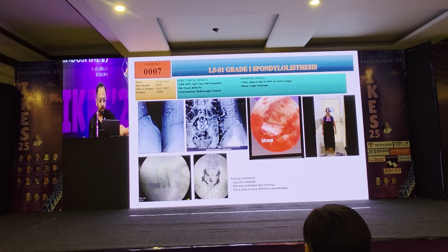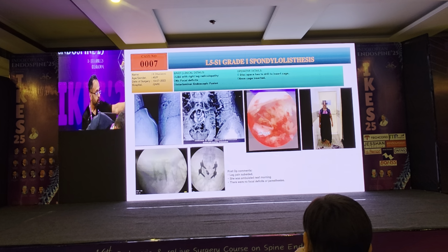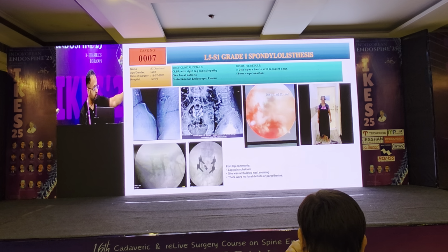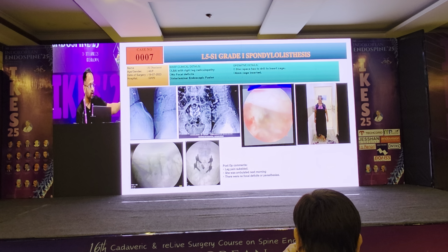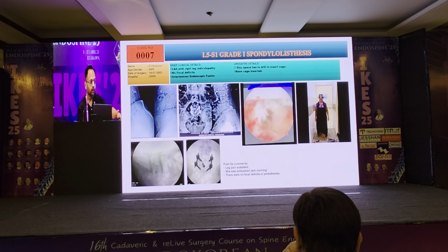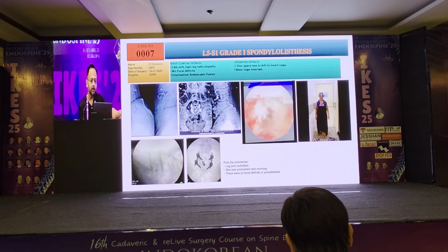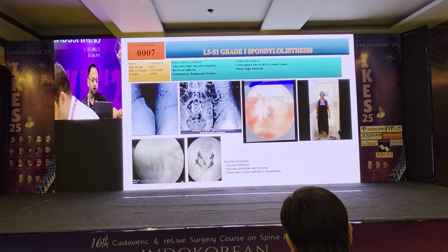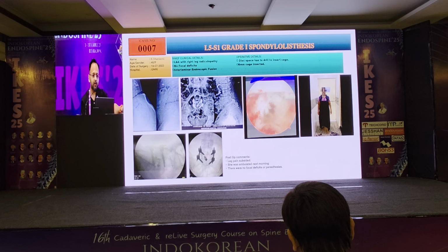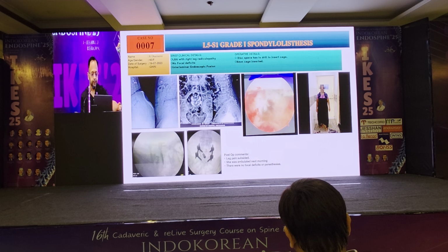This is one more video. You can see the L5 root, that is the exiting root at L5S1, and you see the S1 root. Both the Kambin's triangles are completely decompressed. You can see below is the cage. So it's an ideal TLIF. The S1 has been decompressed and the exiting root of L5S1 has also been taken care of. It implies the facet has been completely knocked off, and up to the pars has been removed.